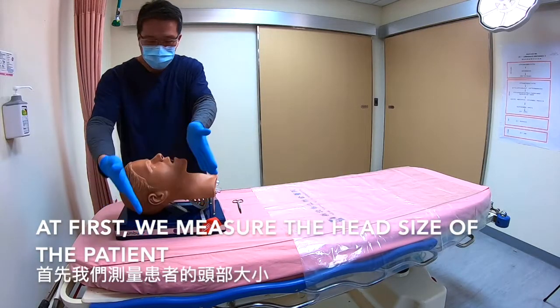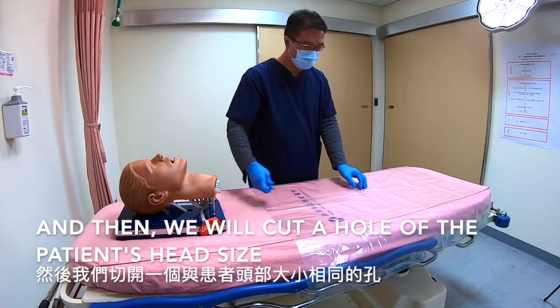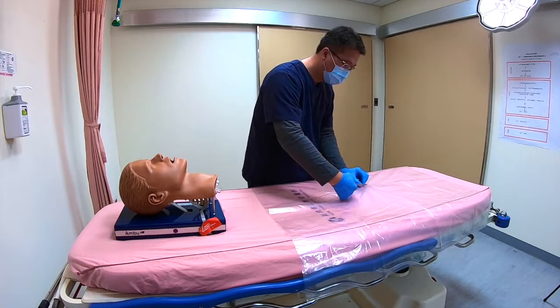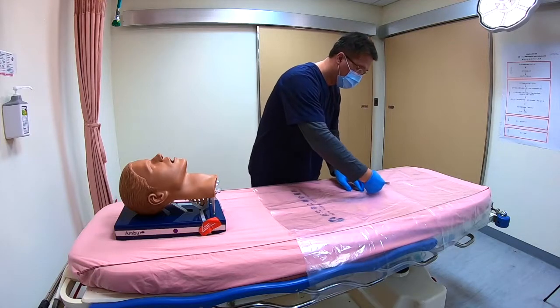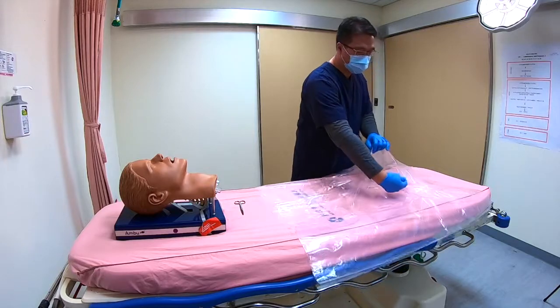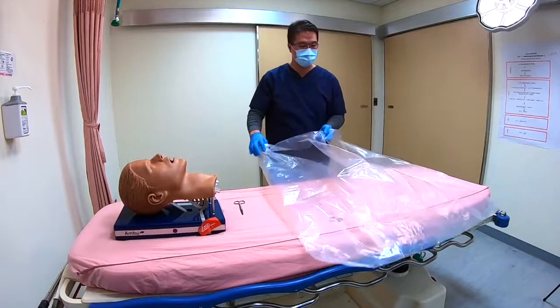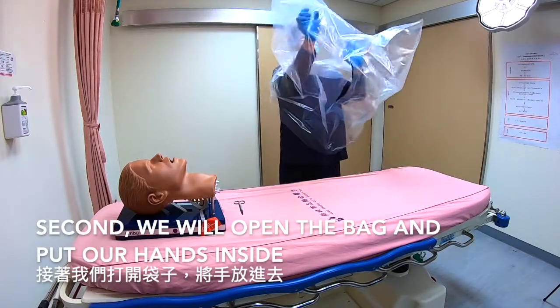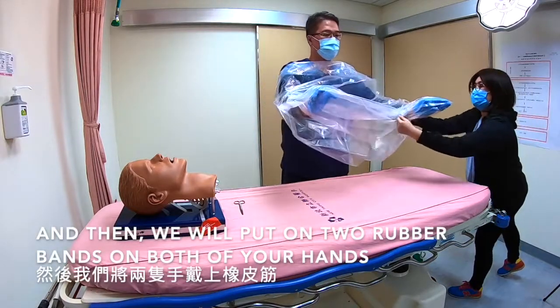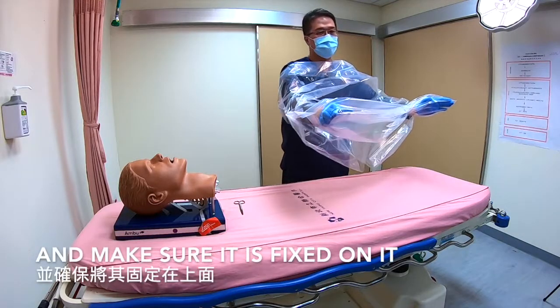First, we'll measure the head size of the patient and then cut a hole of the patient's head size. Second, we'll open the bag and put our hands inside. Then we'll put on two rubber bands on both of your hands and make sure they're fixed.